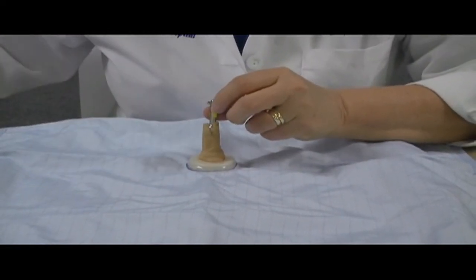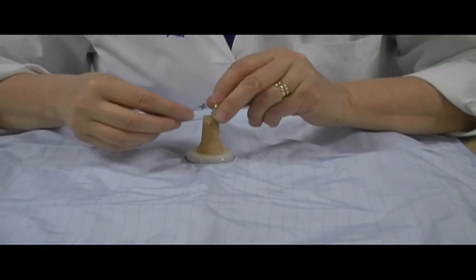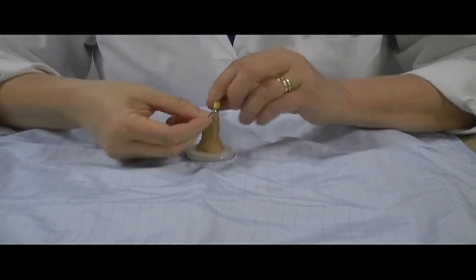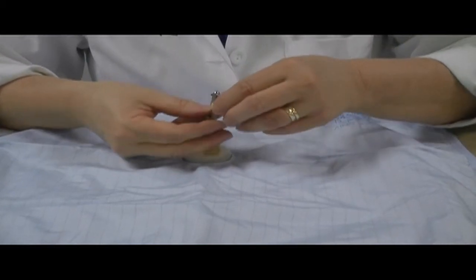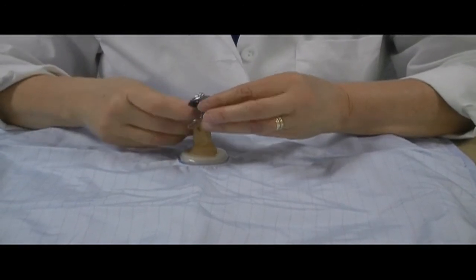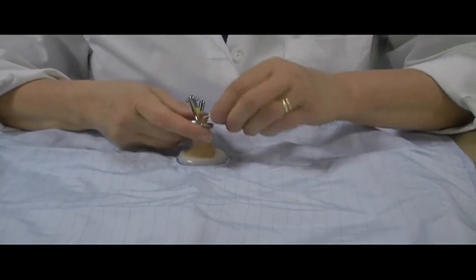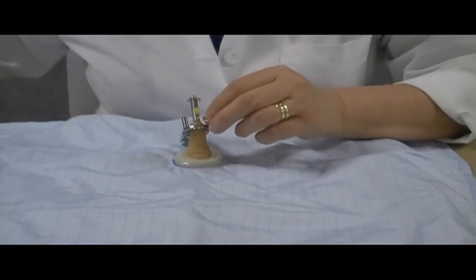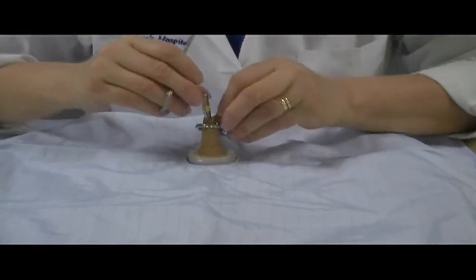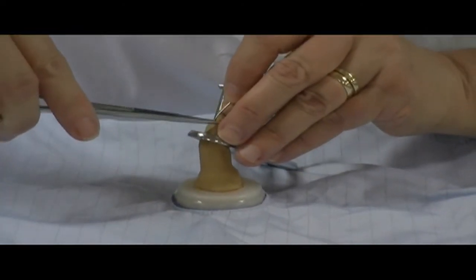And at our institution, we will use a safety pin then to be able to help us maneuver that foreskin above the Gomco clamp. We are using a 1.3 Gomco in this simulation model, as it is the easiest to use over the bottle nipples. Sometimes you have to again use another hemostat to be sure that all of the foreskin that you want is above the tissue, also being sure that the apex of the incision is well above the clamp.